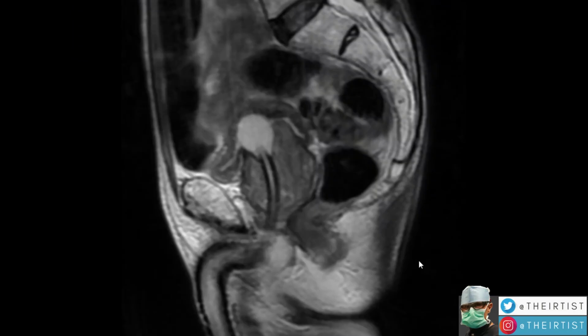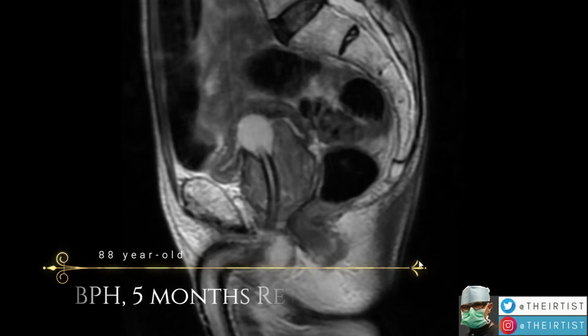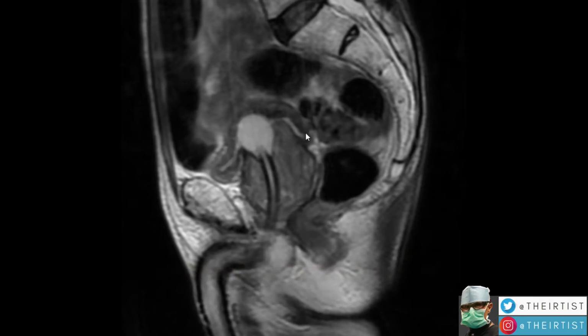So I'm showing today the case of this gentleman, an 88-year-old gentleman with a history of BPH, benign prostatic hyperplasia, with complete urinary retention, requiring the placement of an indwelling long-term Foley urinary catheter that I'm showing here on the MRI. This is the balloon, this is the Foley, this is the bladder of the patient, which is empty. Inside is the urine, and this is the prostatic gland of this patient, which is enlarged.